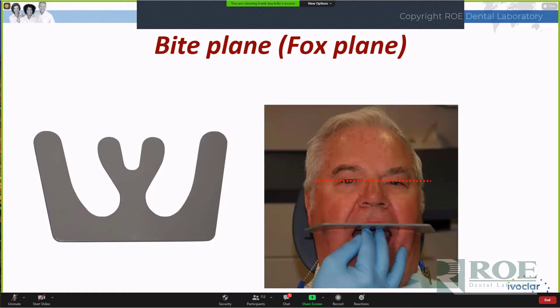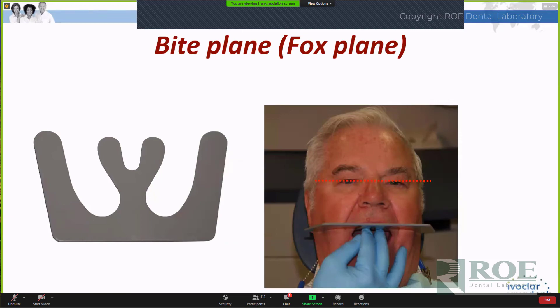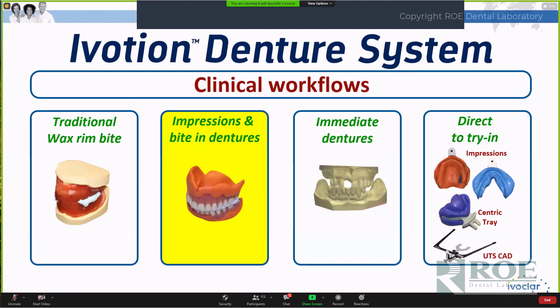Another tool is a fox plane of sorts, which we refer to as the bite plane. It's a way of amplifying the rim as you're making changes to it, to make sure it reflects the patient's bipupillary line — because that information is going to be given to the laboratory and that's what they'll follow. You have the opportunity to test this intraorally at this stage. These are great tools to have.